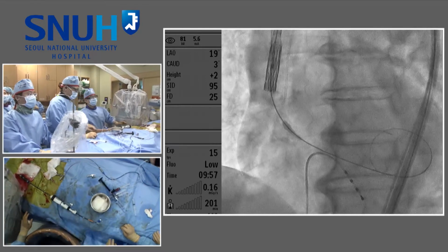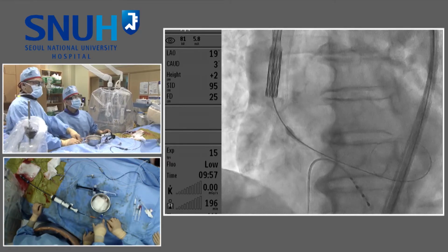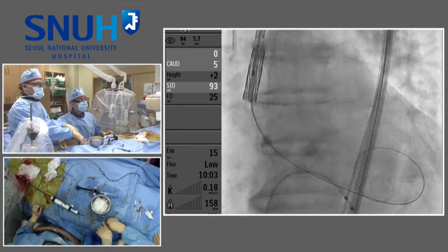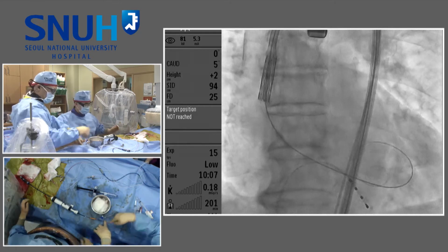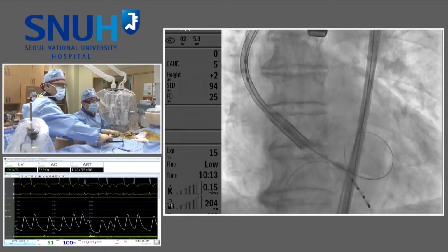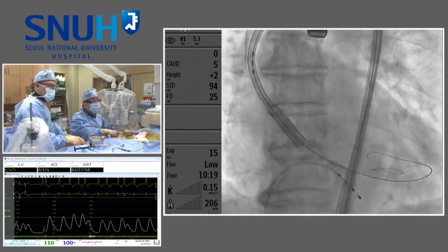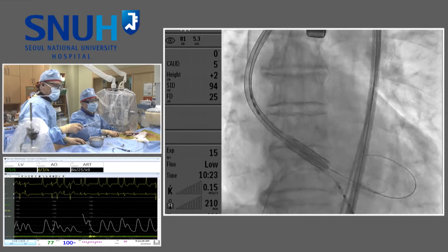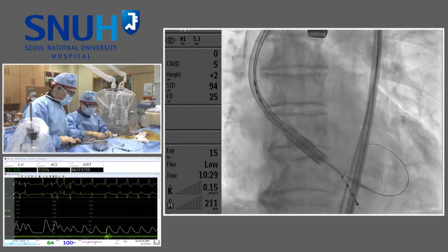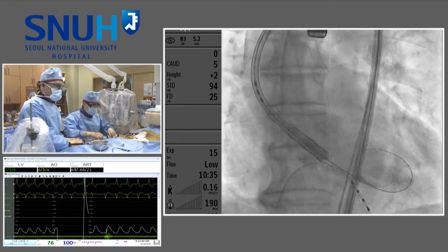So for the bicuspid AS, which valve do you prefer, Dr. Grube and Dr. Nanda? Well, first of all, I don't want to comment while he's doing the case, because for me it's a very difficult decision in this situation, which valve. Both valves have advantages and disadvantages in this situation. Obviously, it's what you feel comfortable with. What I would have done, though, is I would not have taken a 29. I tend to undersize in bicuspid calcification situations, both for SAPIEN and for the other valve. But let's see. We pray, so it's okay.